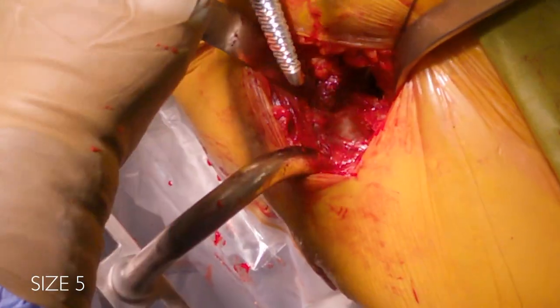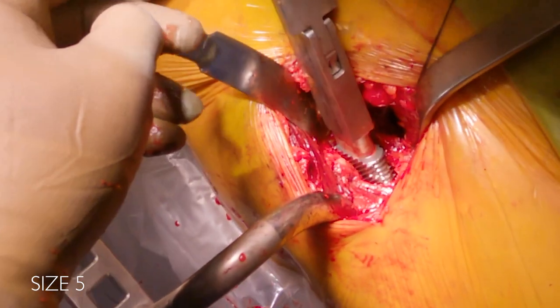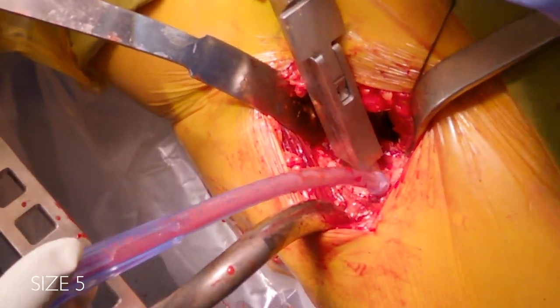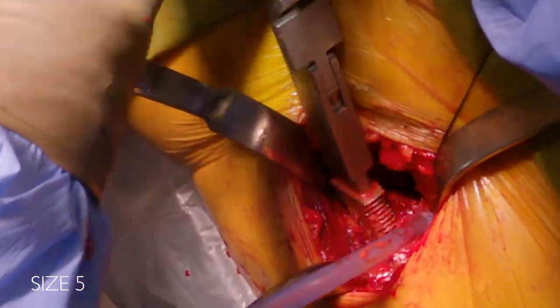The size five is going in right now — it really efficiently goes down into the canal. I'm not doing a lot of force, just letting it find its path.